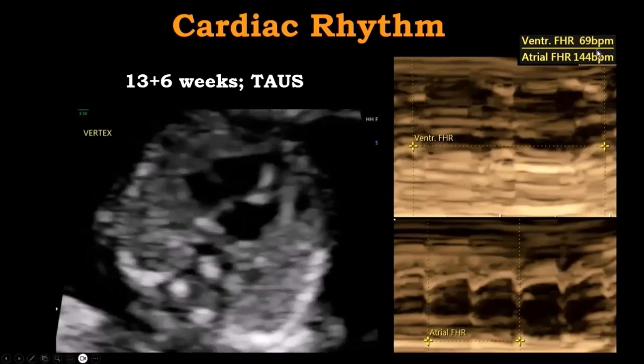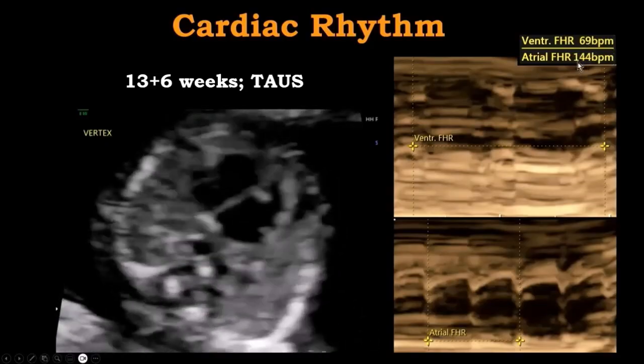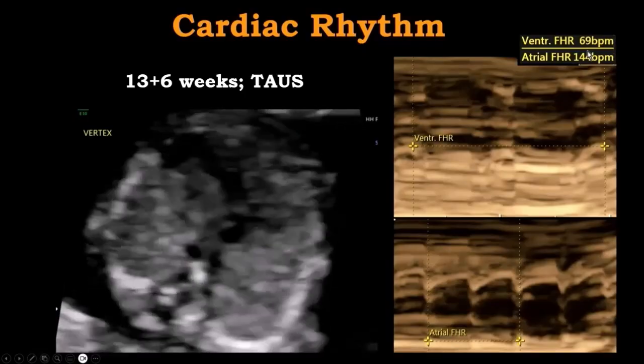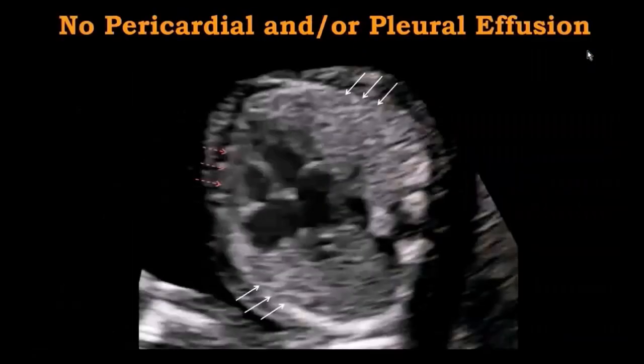So in here we have the heart rate, which is different. For the atria, we have normal 144, and for the ventricles, it's 70 beats per minute. So this already indicates the block, and this is an important finding.